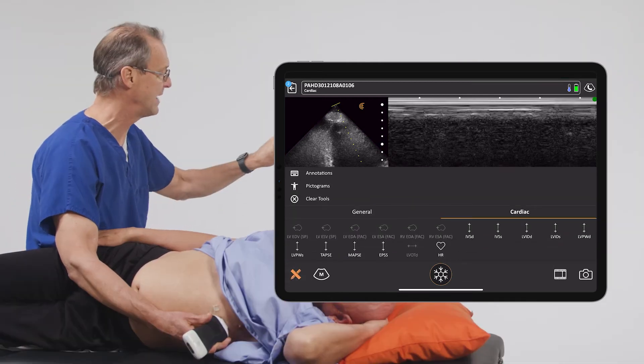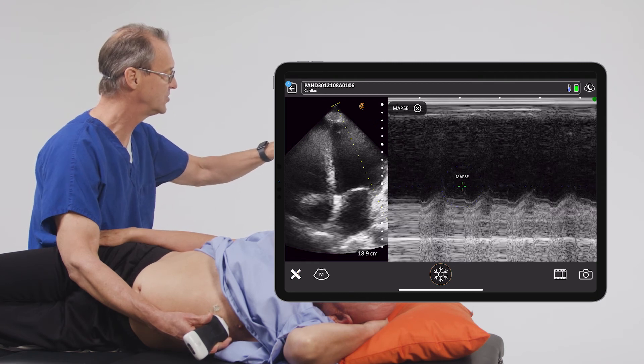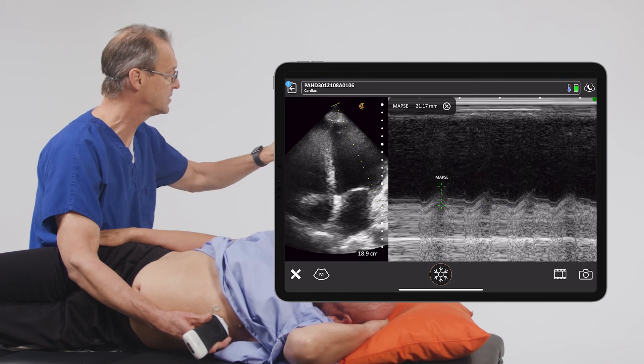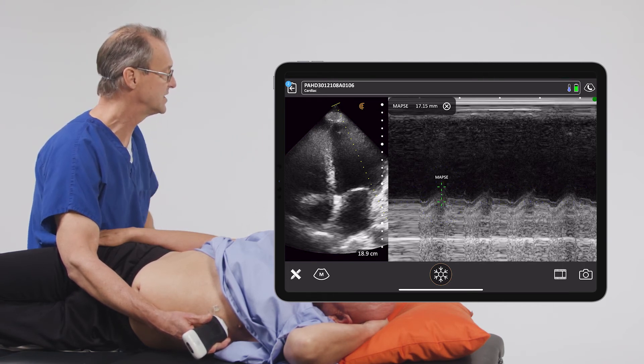We're going to measure MAPSI, and when we do that and touch the screen, it gives us two parallel lines. We put the first line down here in the trough and we put the second line on the peak, and we take that measurement — which we see up here — which is 17.